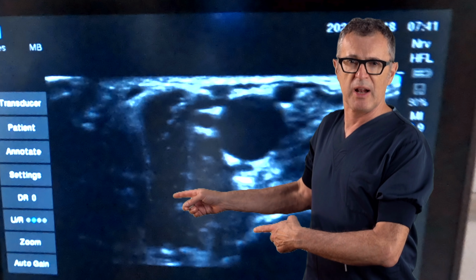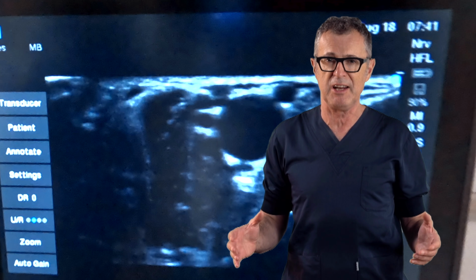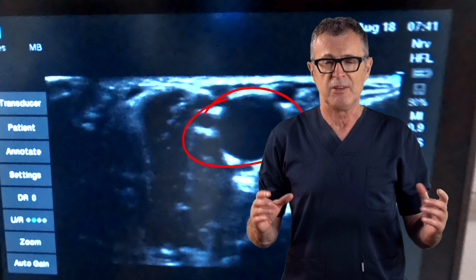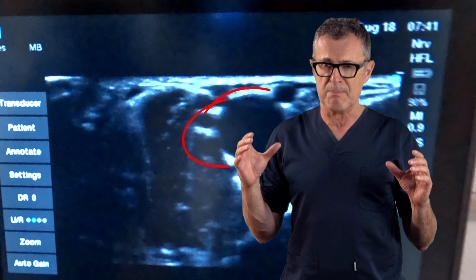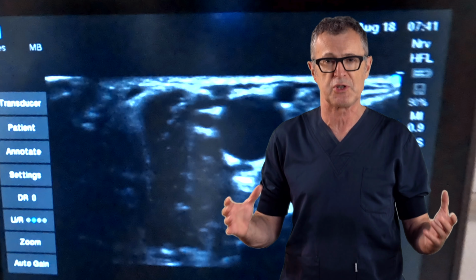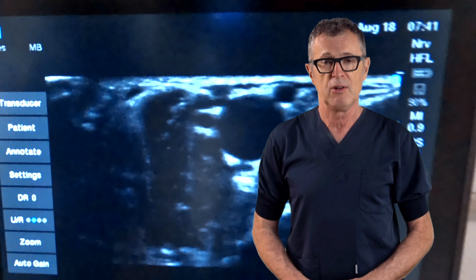Although the anatomy is well visible here, the challenge, as you will see, is guiding the needle into the axillary sheath while avoiding the axillary artery. The lack of adipose tissue makes this much more difficult, and the patient weight imposes restrictions in dose and volume of local anesthetic to avoid local anesthetic systemic toxicity.